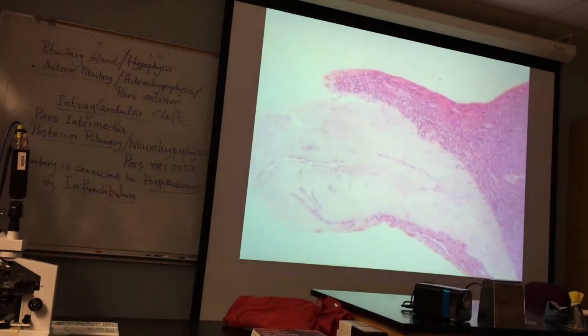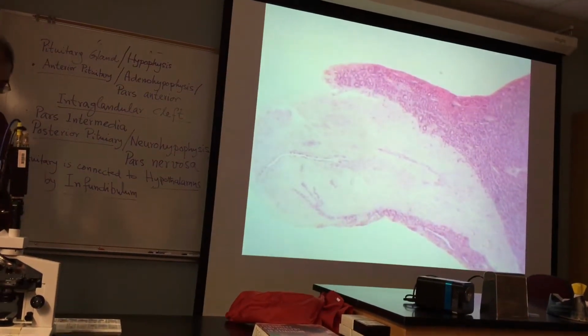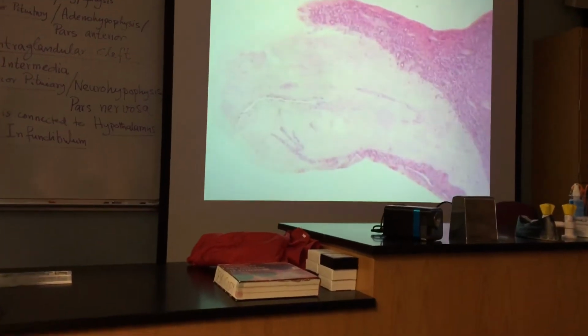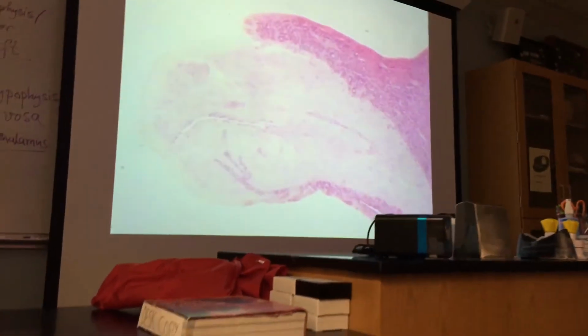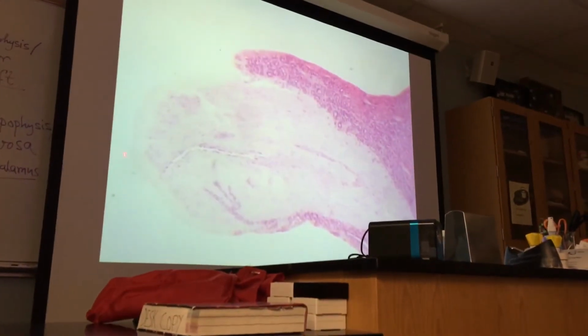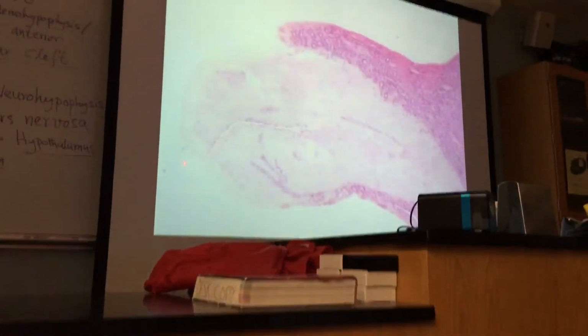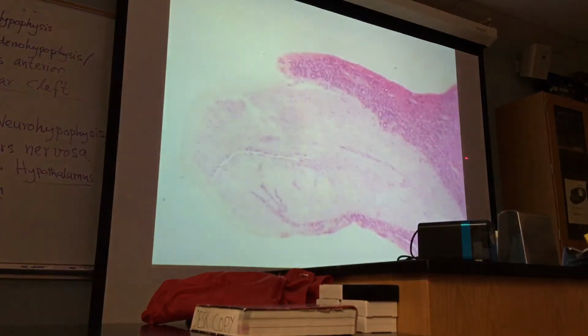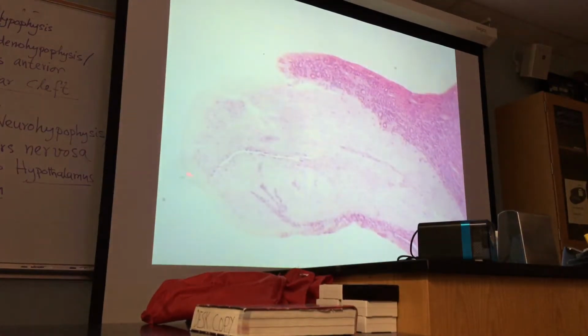So, if I ask you this question, what should be present here? Hypothalamus. Because this infundibulum attaches the pituitary to the hypothalamus. Look at this chart.